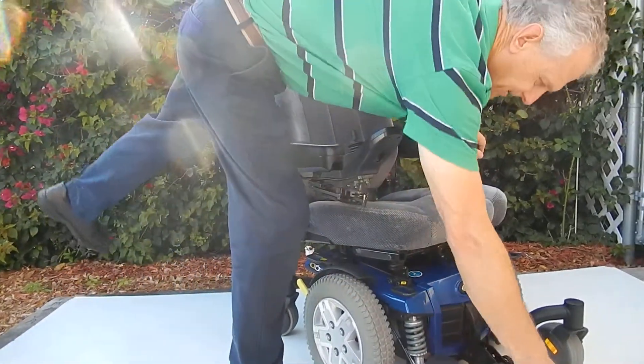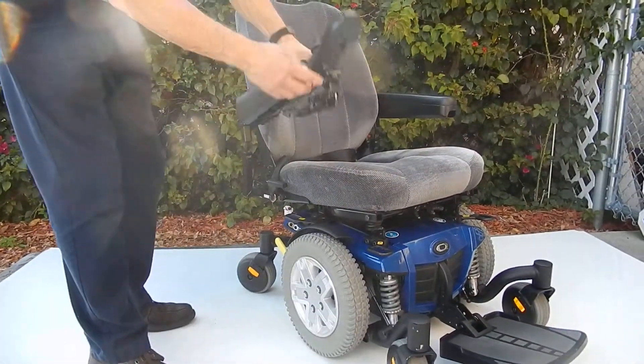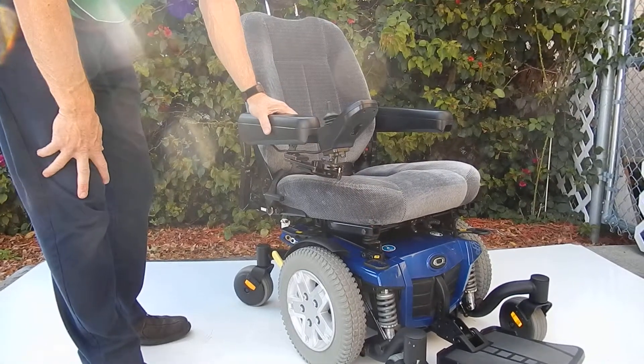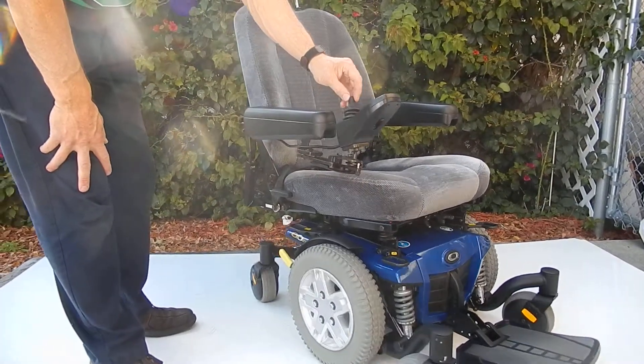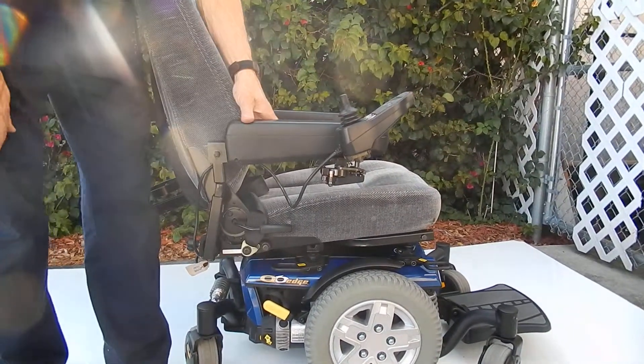The foot plate flips up. When you need to charge the chair, you charge it from the front at the joystick over here — plug it right in — and the charger will stop charging when the chair is full. This chair also has a swing-away joystick, which will swing away from the front to the side.